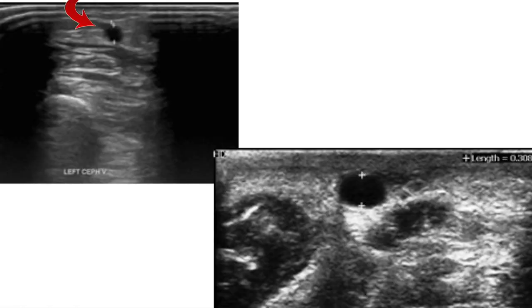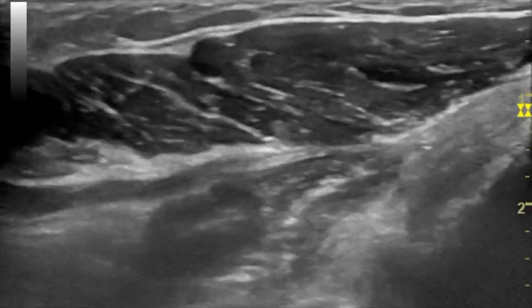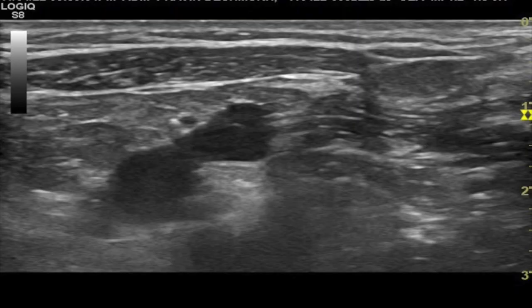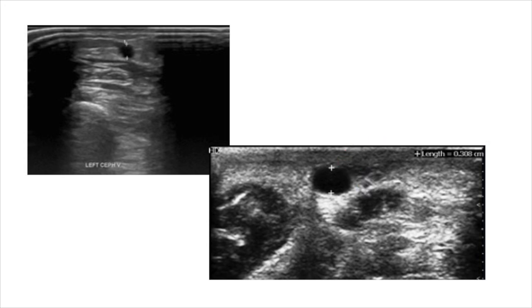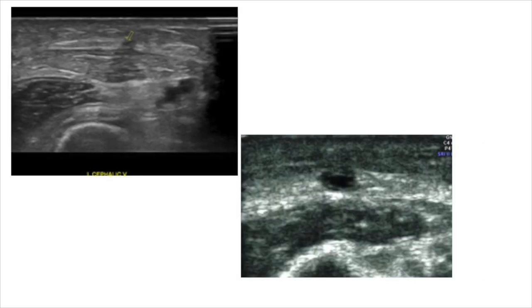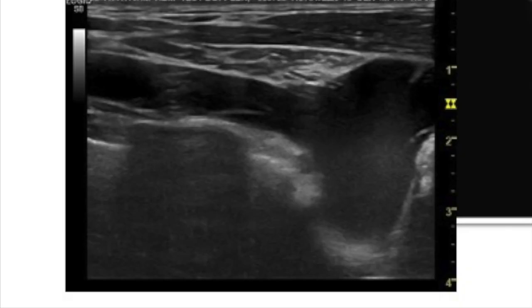This is a normal cephalic vein where you see thin walls; you can actually measure it wall to wall. This is a very good three-millimeter sized cephalic vein, which is usually an excellent diameter for selection for an arteriovenous fistula in ESRF patients. This is an example of a very small cephalic vein with thick walls, patchy thrombosis, and the lower image shows a thickened venous wall which is very characteristic of superficial phlebitis. Similarly, just like the cephalic vein, you should also include evaluation of the basilic vein, and after finishing superficial venous evaluation you move on to visualization of the deep veins.